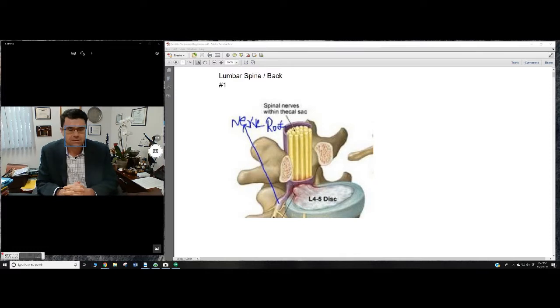A lot of people ask, how do I understand my MRI report? I get my MRI report and how do I interpret it? Well, an MRI report is going to have some basic information like your name, the name of the facility, the address of the facility. It's going to also have the report date and the exam date, as well as your date of birth. And then down at the bottom, it'll have the impression.